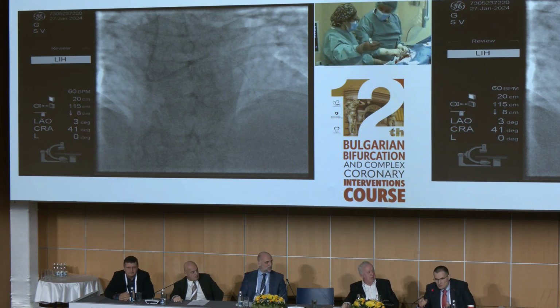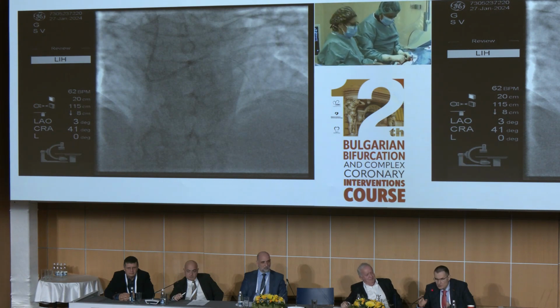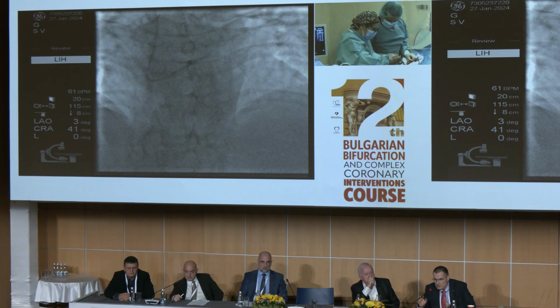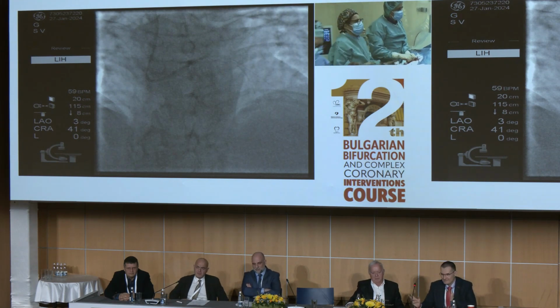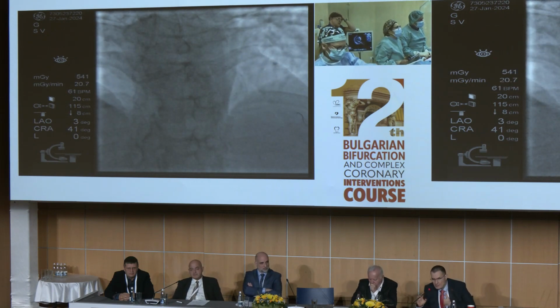So guys, you decided to do a second POT and then to do IVUS, yes? That was your proposal. I think Eve was just guiding us. So we are going to do this, and probably after that we'll find out.